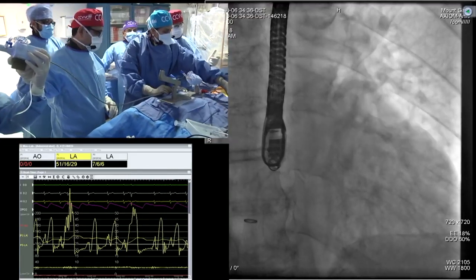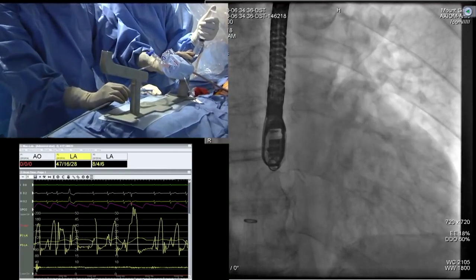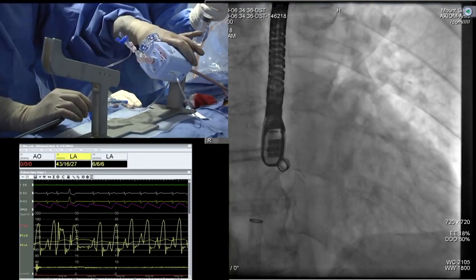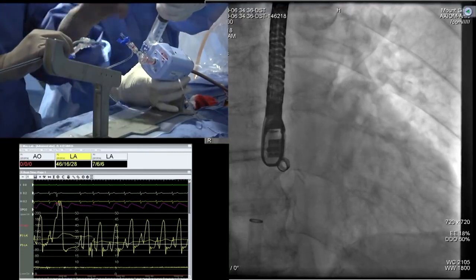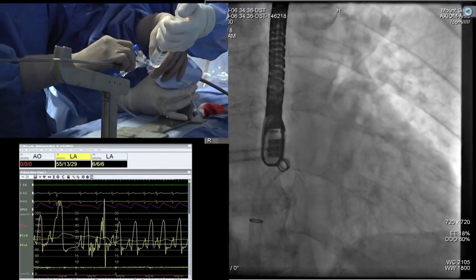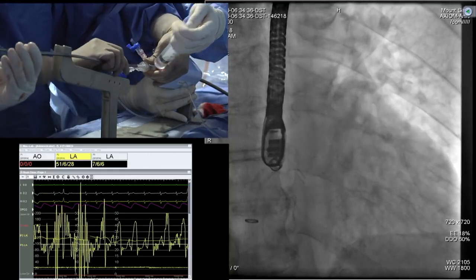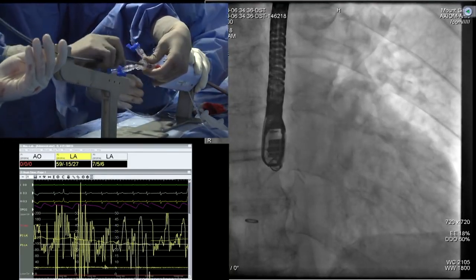So the steerable guide movement is the same. If you go clockwise, this is anterior, and if you go counterclockwise it is posterior. Just remember that, okay? Now will be introduction of the clip. Same, you have one person, it will be fluid. And as you enter here, okay, good. And now your blue to blue connection has to be good.